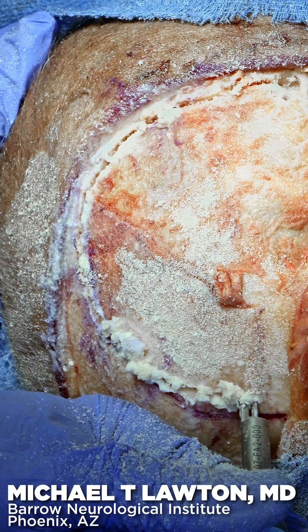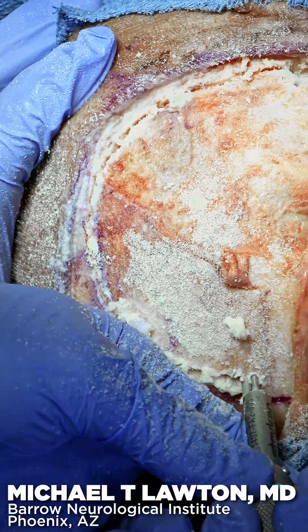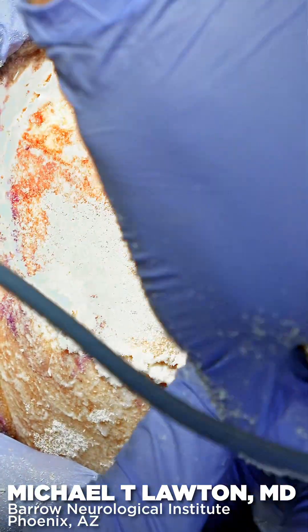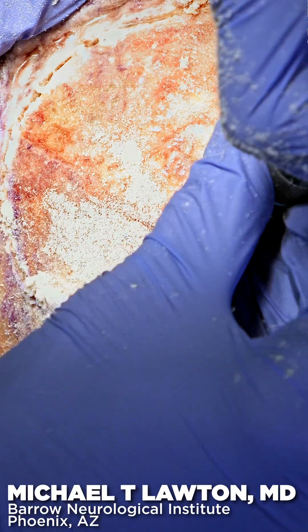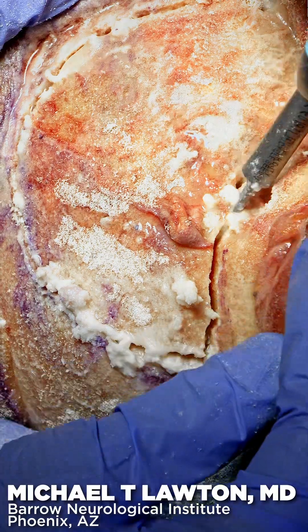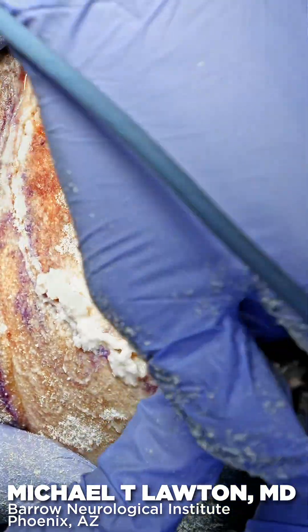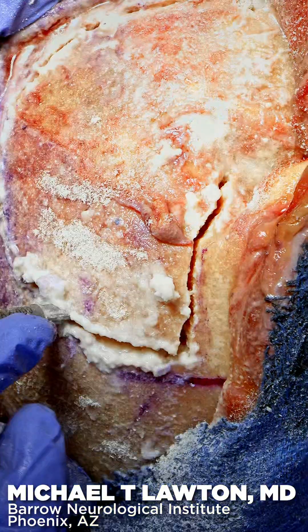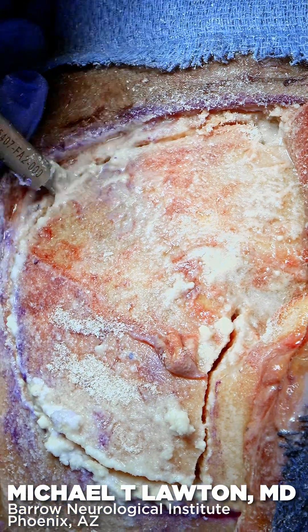When I get to the floor of the anterior cranial fossa, I can feel that with my footplate, and that tells me it's time to make my turn. I'll take that cut all the way to the pterion — the footplate will run into the pterion. It's like a little ridge on the inside that you can't see on the outside. And that's your end point there.